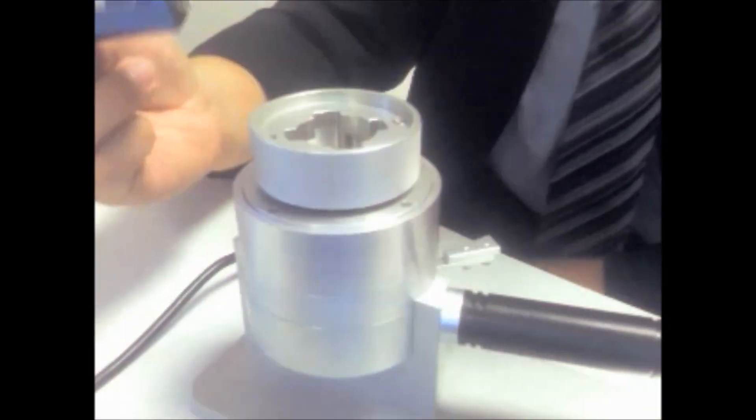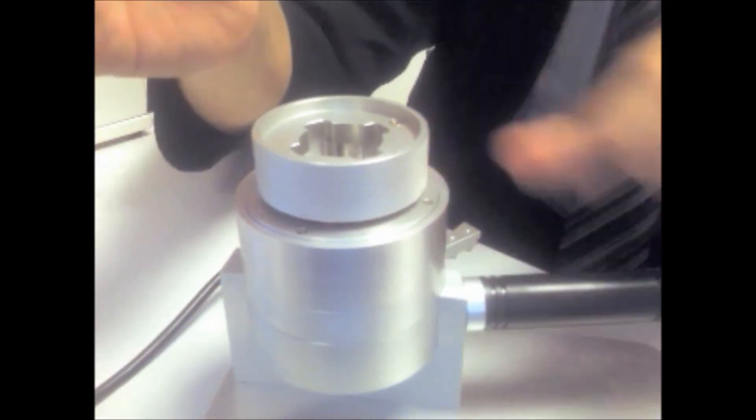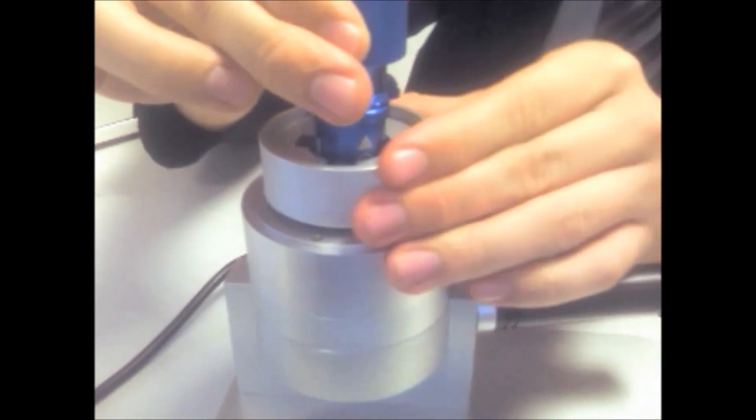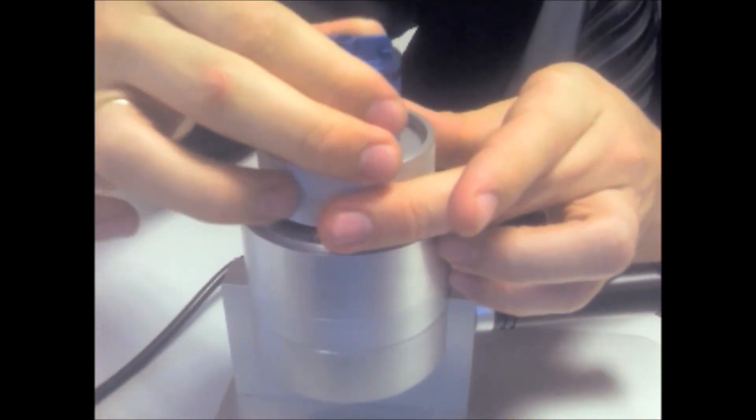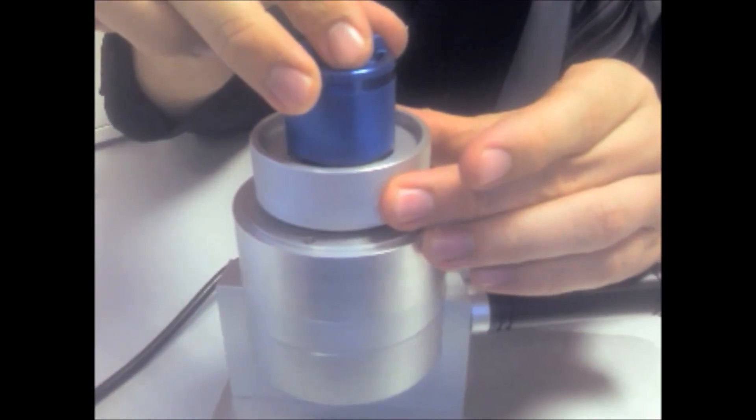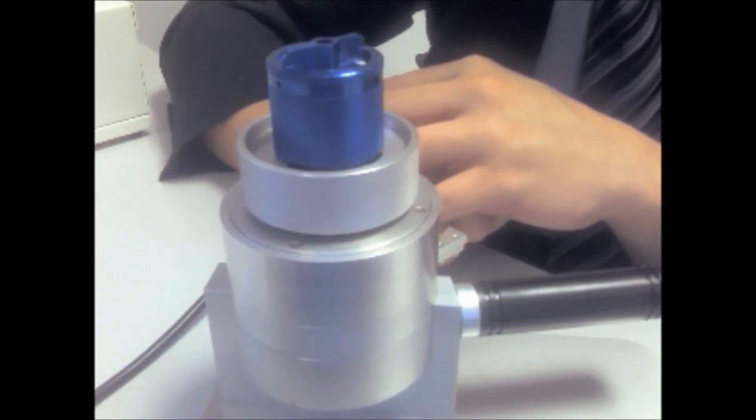The next step is to insert the blue loader into the capsule opener. When you insert this, you need to insert it in alignment with the prefabricated holes and twist in an anti-clockwise motion to lock the blue loader in place.